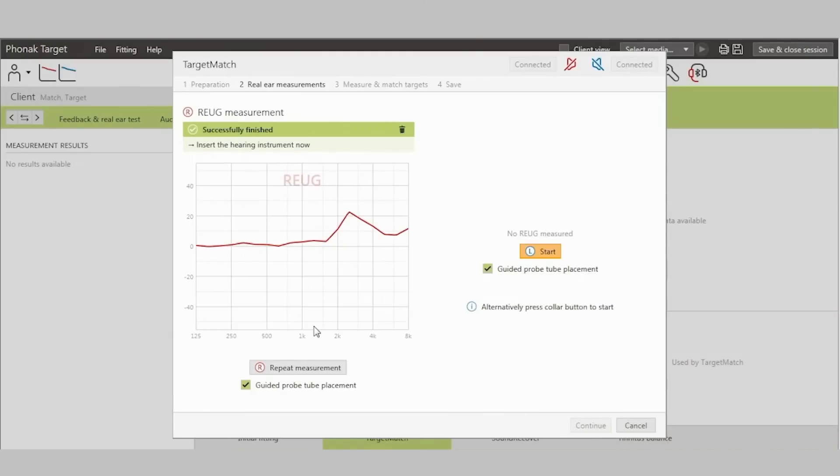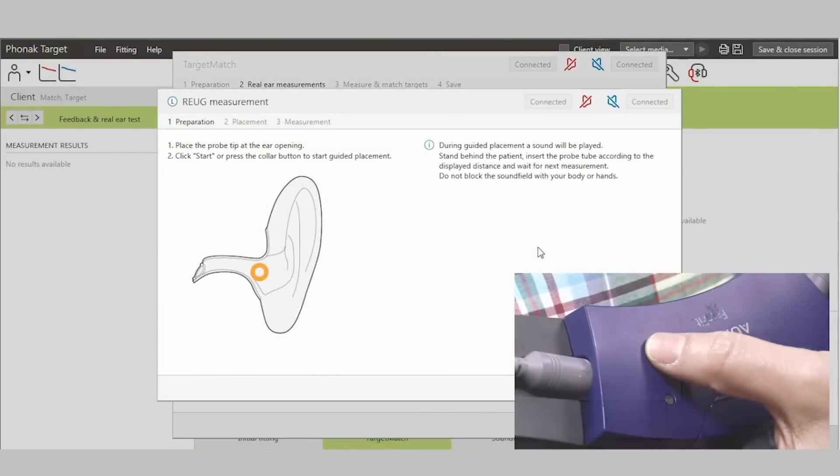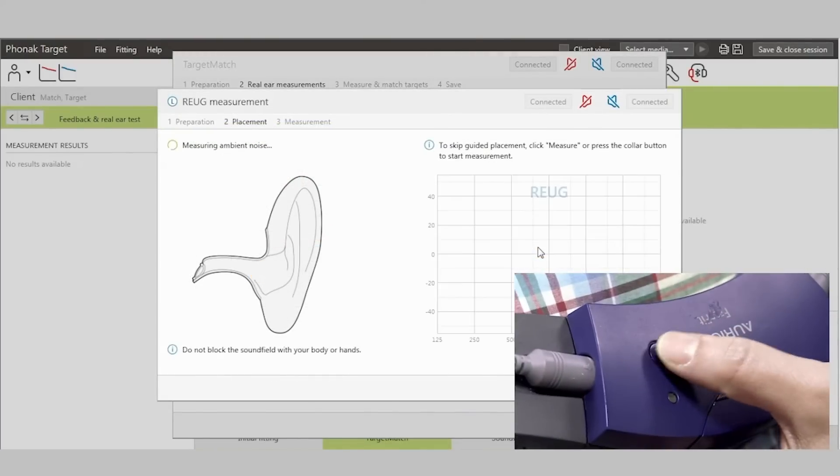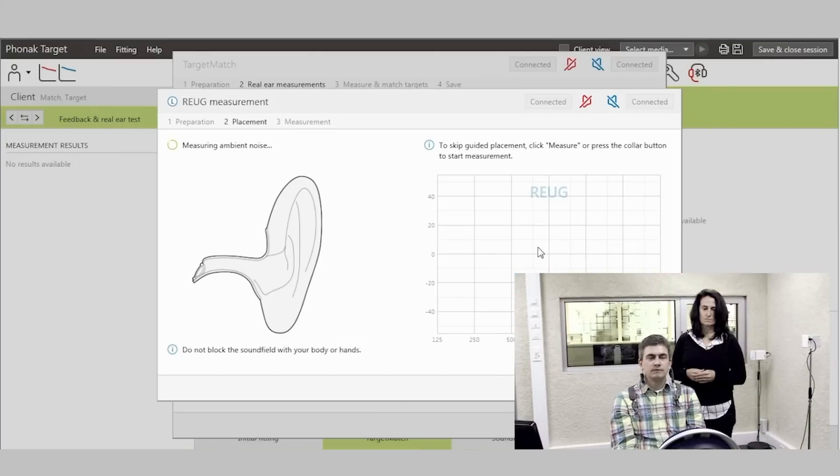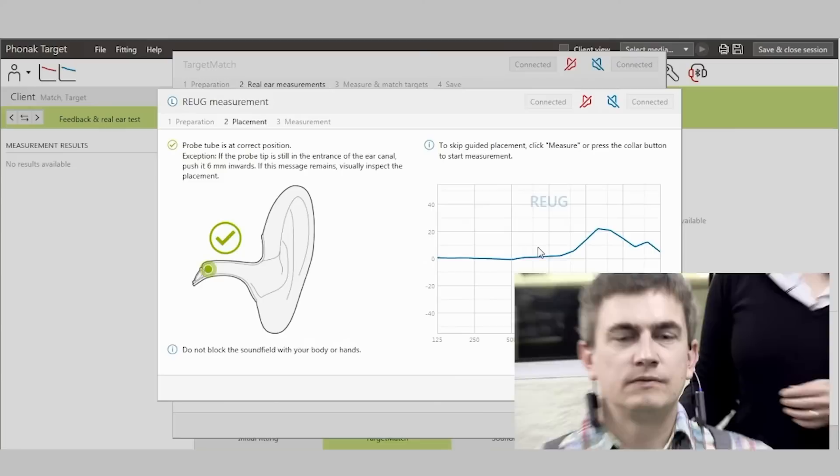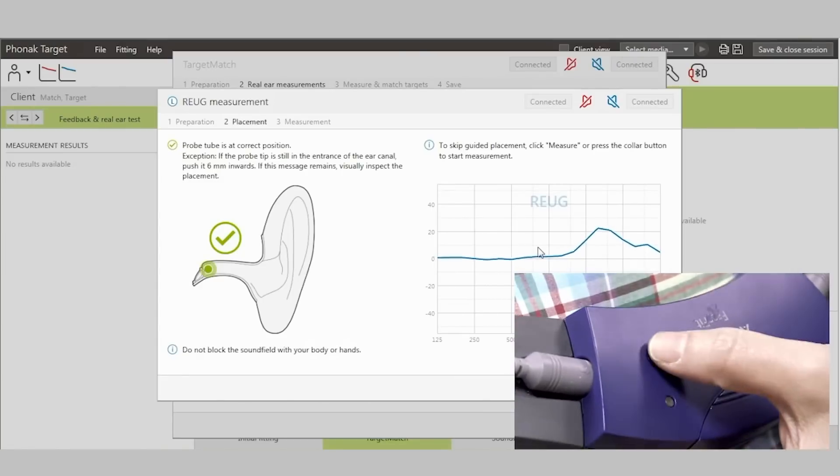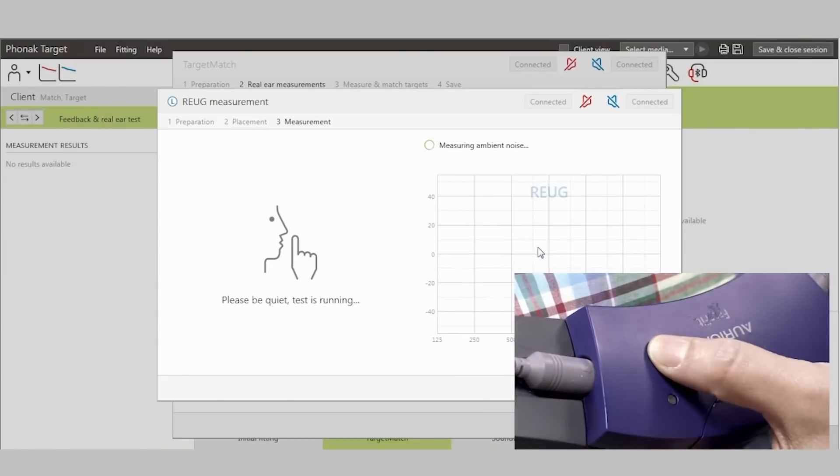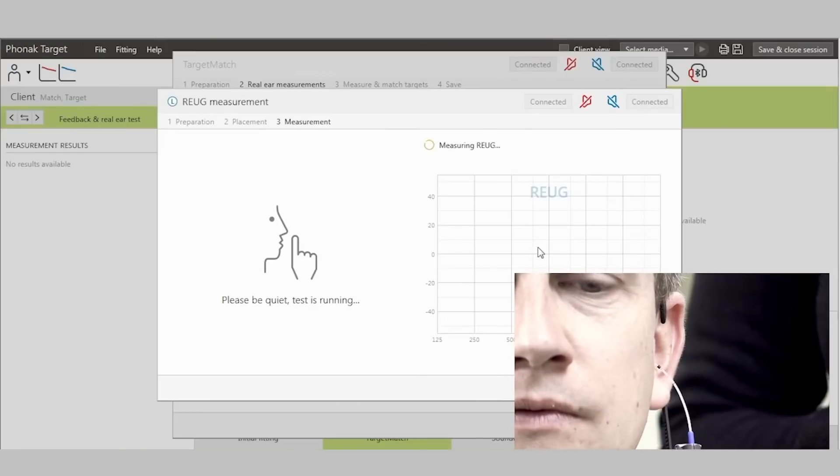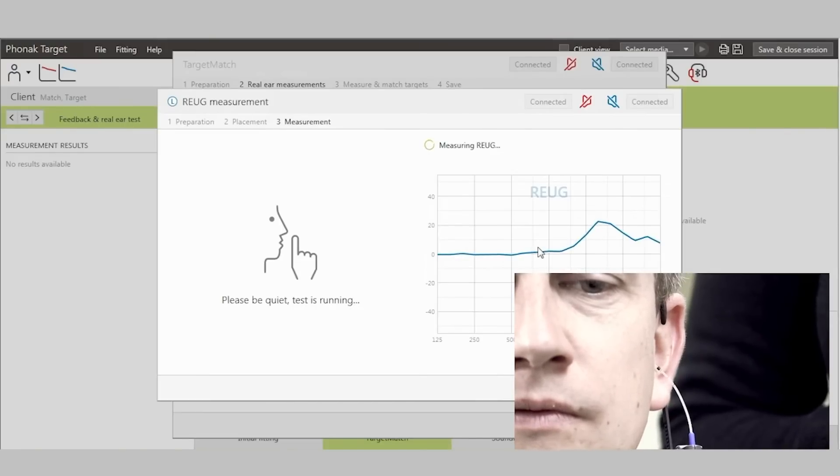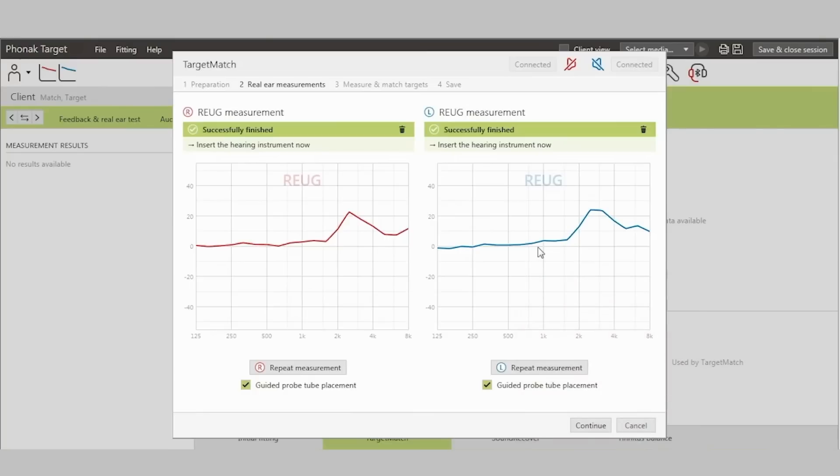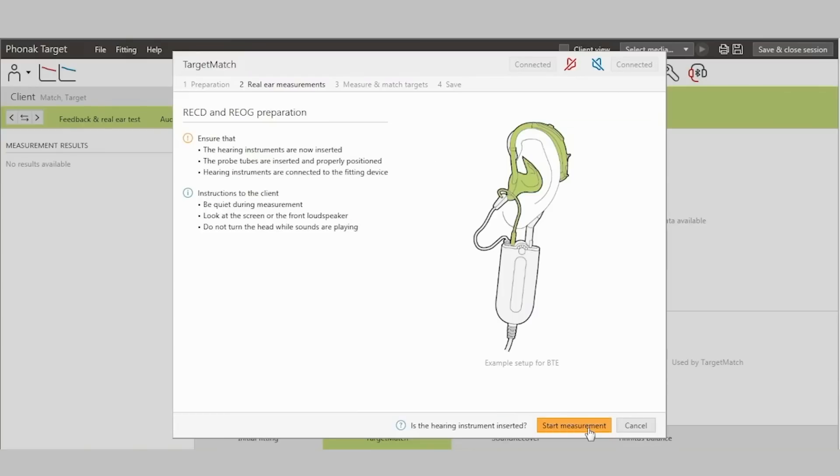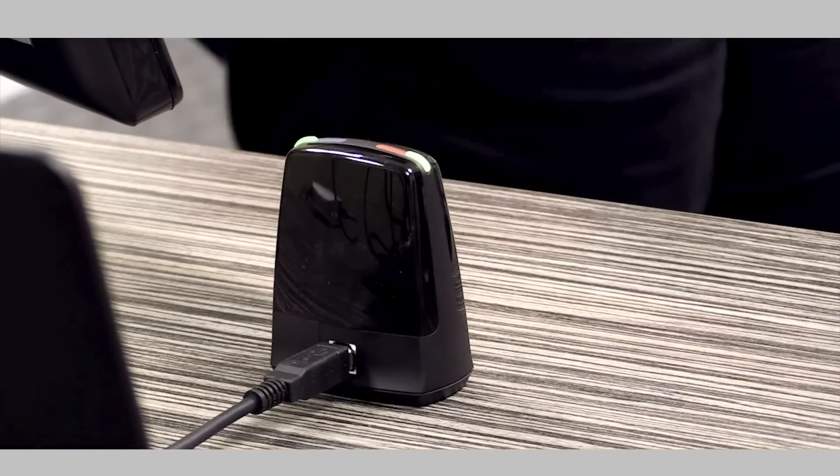This process is then repeated for the second ear in a binaural fitting. Once the REUG has been measured, the real ear to coupler difference (RECD), the real ear occluded gain (REOG), and the microphone location effects are measured. To perform these measurements, I place the hearing aids into the ears.